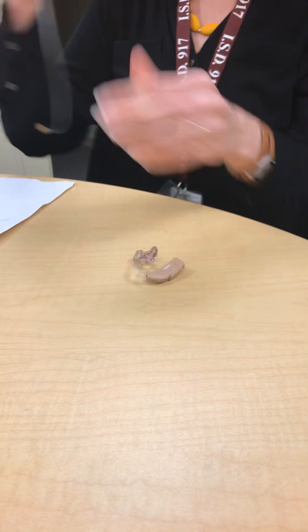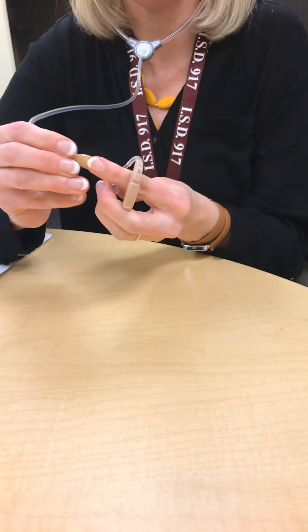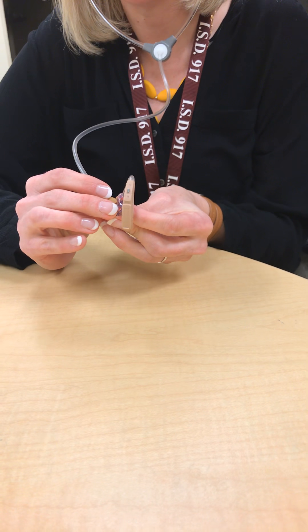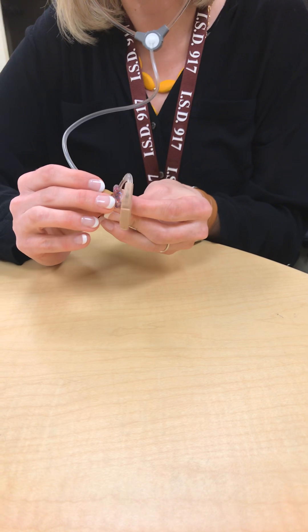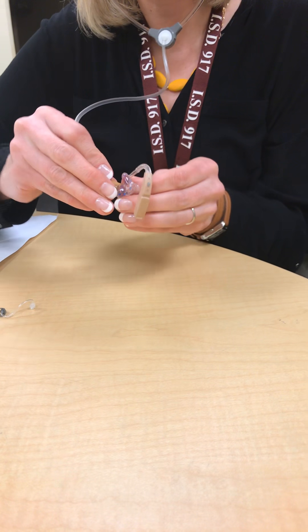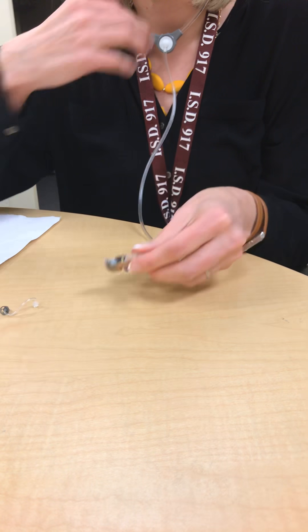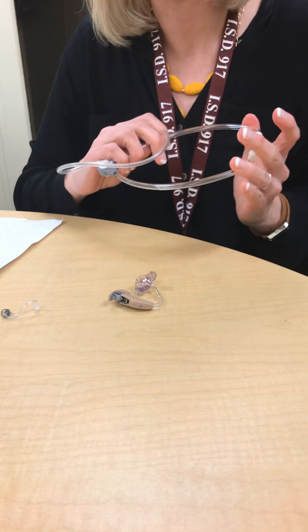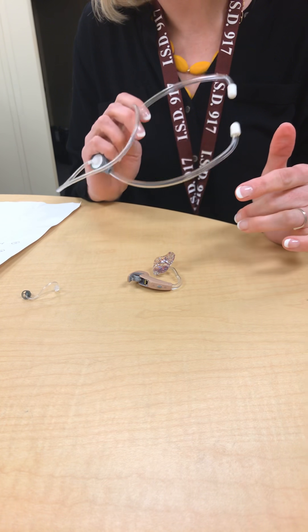You always want to use the listening tube that is provided to listen to the hearing aid. Simply put it in your ear like a stethoscope, put the tube ending over the end of the hearing aid, and then say the Ling sounds. Make sure that all of those sounds sound nice and crisp and clear. That will work with either configuration of tubing. It's a nice way to check it if you don't feel comfortable doing the Ling sounds for the student while they're wearing it — a nice way for you to hear if there's any distortion inside the hearing aid.